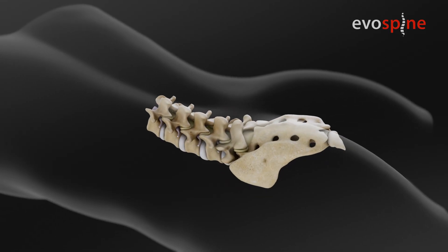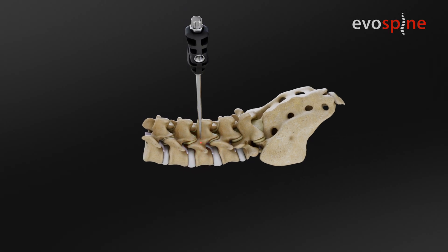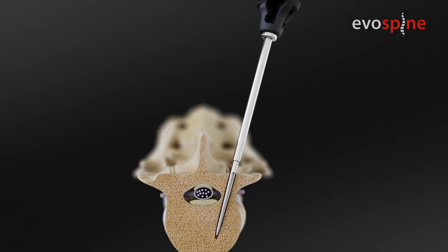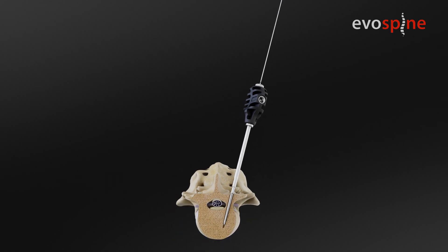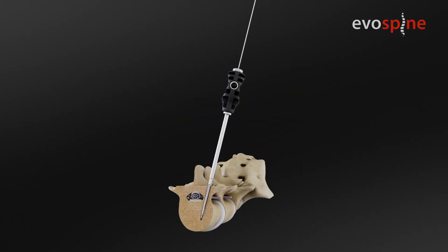Bone access and approach to the pedicle. Define the incision area and find the pedicle. Place the Jamshidi needle into the pedicle under x-ray control. Place the K wire — the laser mark tip goes inside the bone. Verify the K wire position inside the bone, then remove the needle.